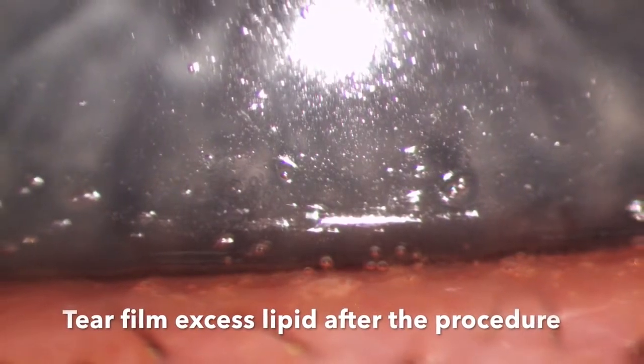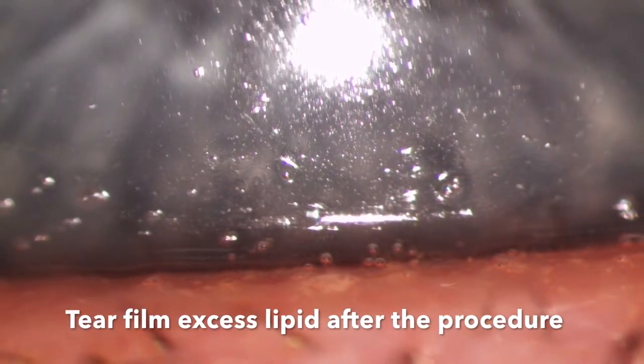Depending on how much you express, you also then get the presence of excess lipids in the tear film after the procedure.